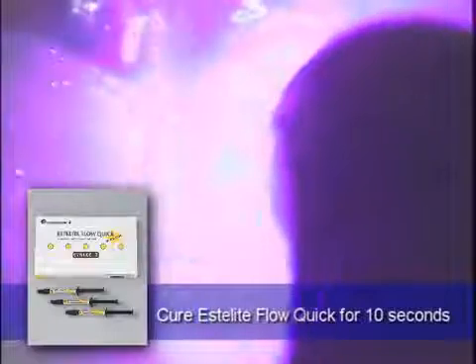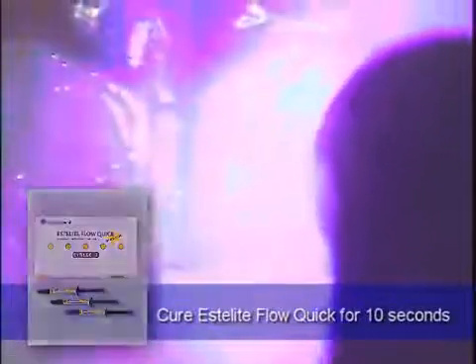It is cured for 10 seconds, followed by the final placement of the Estelite Flow Quick on the facial surface, and is cured for 10 seconds. The mylar strip is removed.